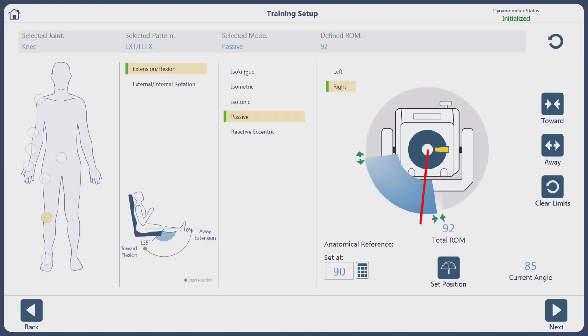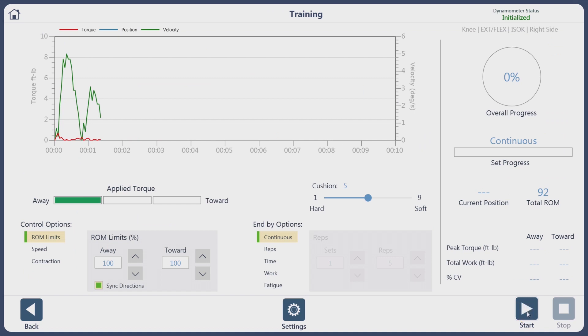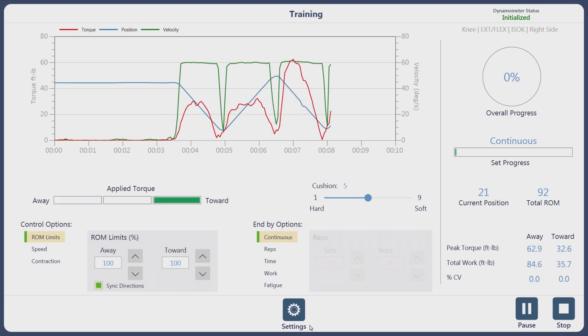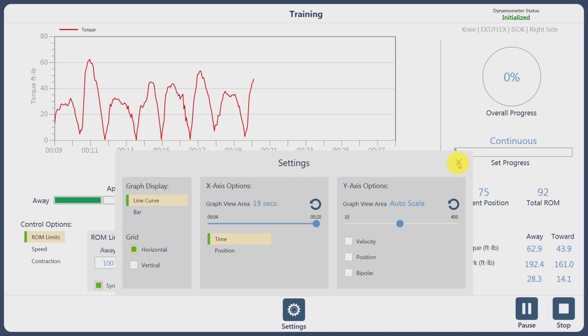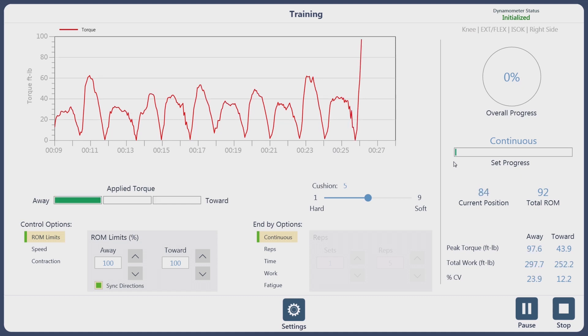We can go back and change to a different mode of exercise — let's say isokinetic. We click Next, hit Start, and now the subject has to move. If we have too much information on the screen, we can take the velocity off and the position off in real time, spreading this out a bit longer so you can see the quadriceps and the hamstrings exercising. And that's your training screen.